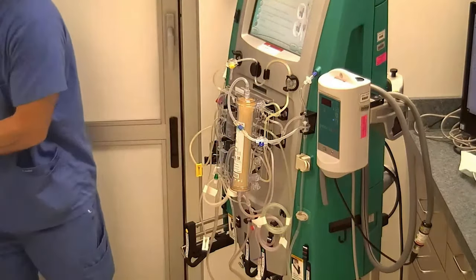And the machine is going to go into its second prime. And it says here that the prime test will happen in 3 minutes. So after this priming bag is finished, the machine will automatically kick into its testing mode. And you'll see there'll be several squares that it will go through. And also from this point, you can walk away from the machine, do what you need to do for your patient, and then eventually come back for connections to your patient.